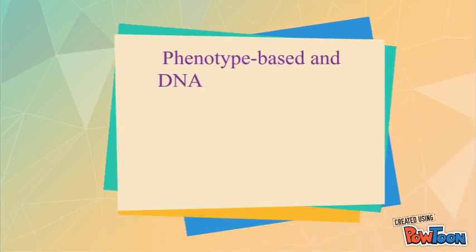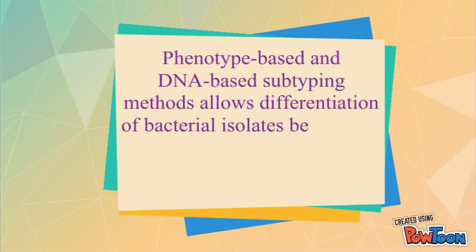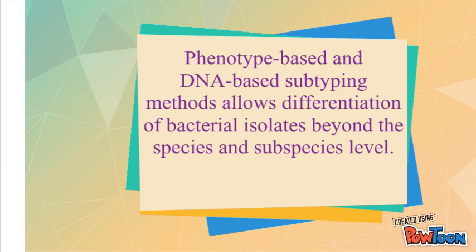Phenotype-based and DNA-based subtyping methods allow differentiation of bacterial isolates beyond the species and subspecies level. It helps in tracking, preventing, and regulating foodborne bacterial diseases based on genetic characteristics rather than the traditional species definitions.